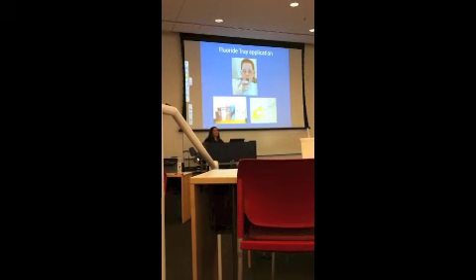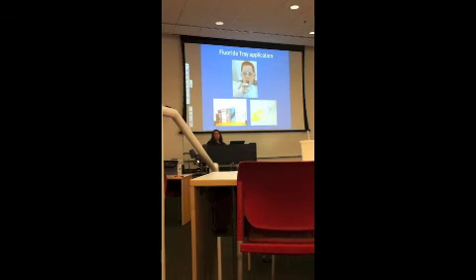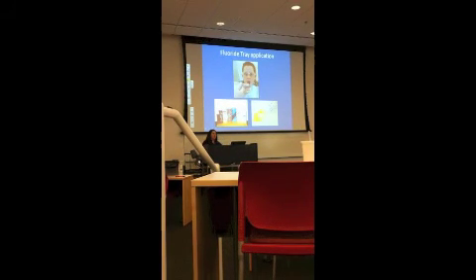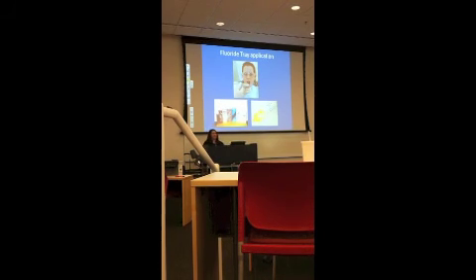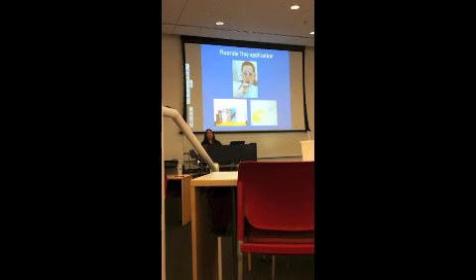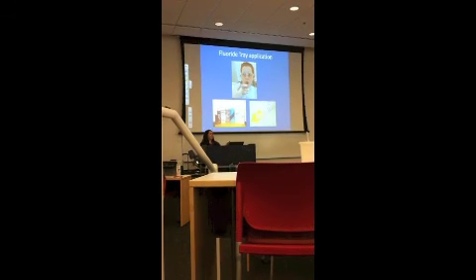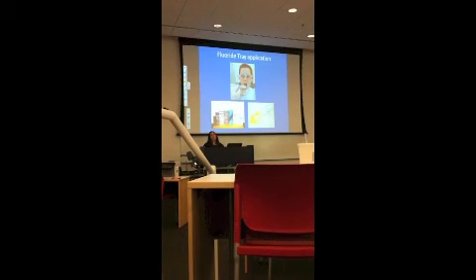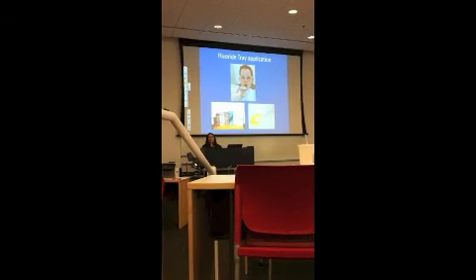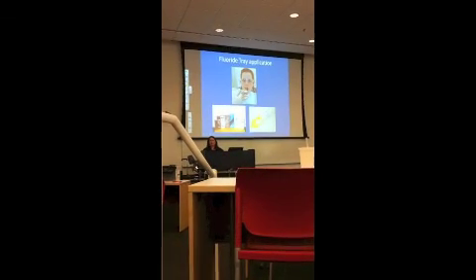Okay, fluoride tray application. Have you guys done this already or not yet? The procedure is pretty simple on the fluoride tray application. In station one, I believe that's going to be the wet lab. You will have different tables set up, different areas set up. There will be 4 different areas. The first one will be application of fluoride foam on the Typodont. So I just basically want you to see the different sizes of the trays that are available out there.